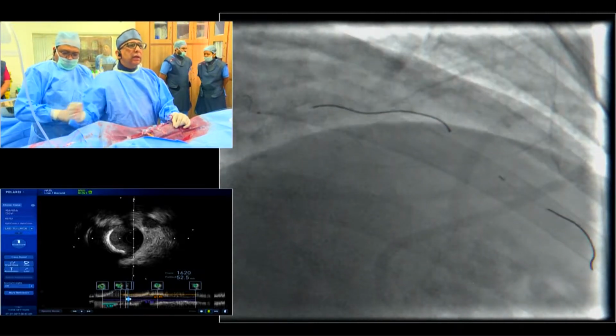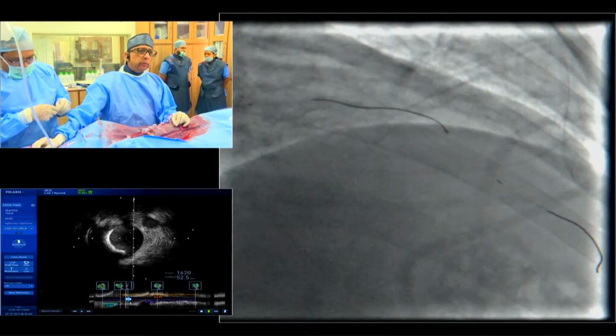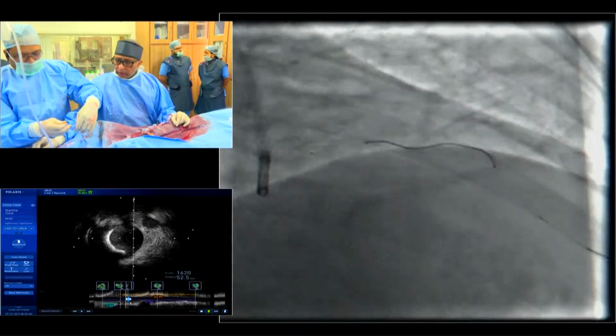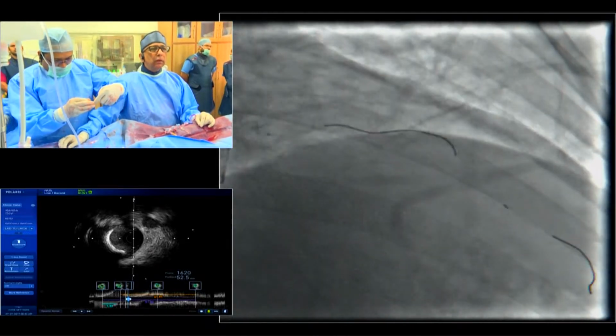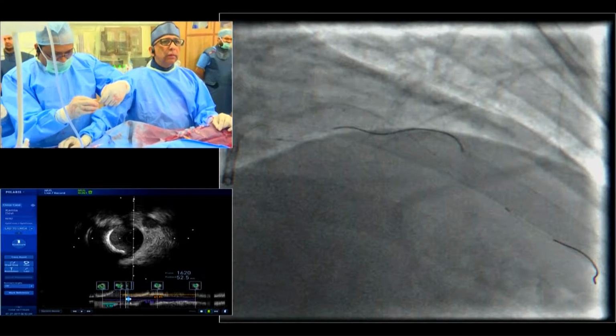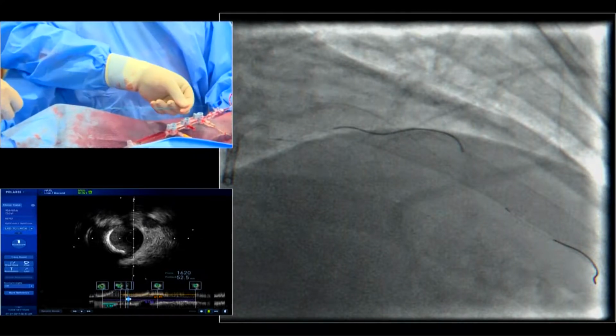So I think after doing the balloon dilatation, I'll put an IVUS, and I'll show you when you come back. Usually, in this case, I will do a pre-dilatation with a 3 millimeter balloon, and again I will see the vessel before putting the stent. May see a better, more dilated vessel.